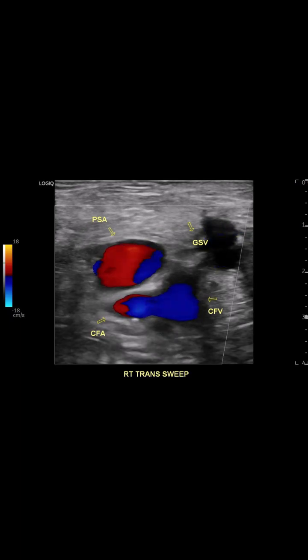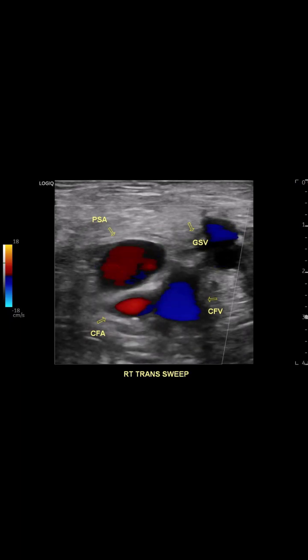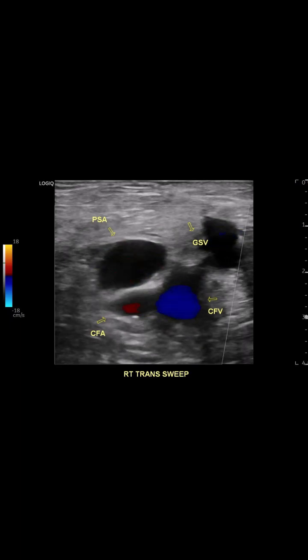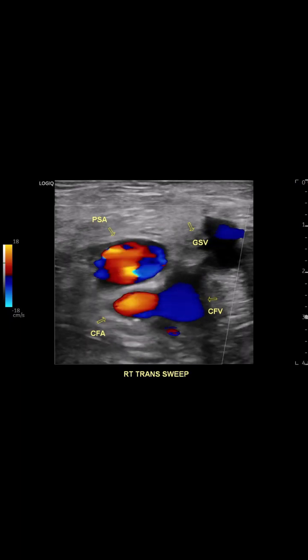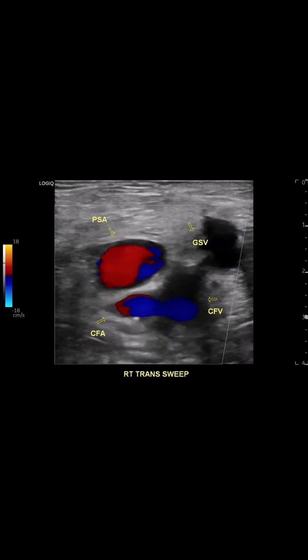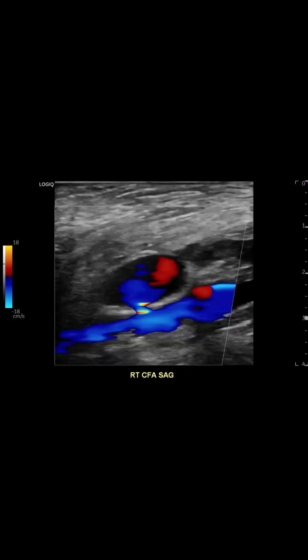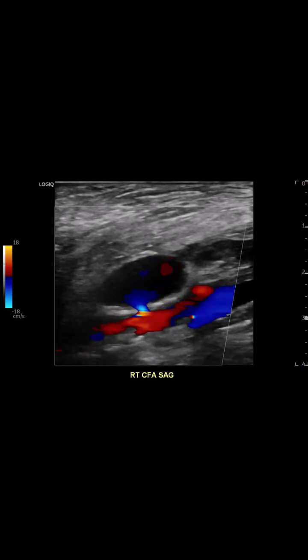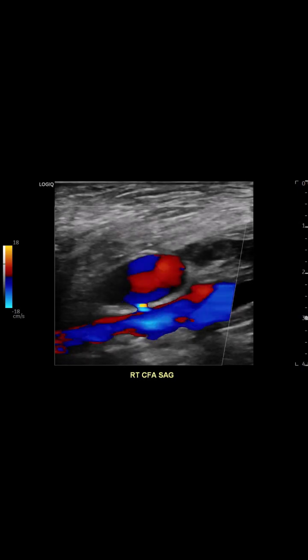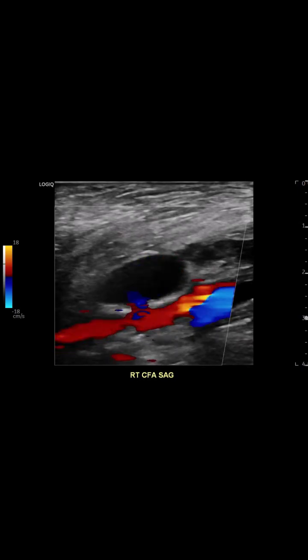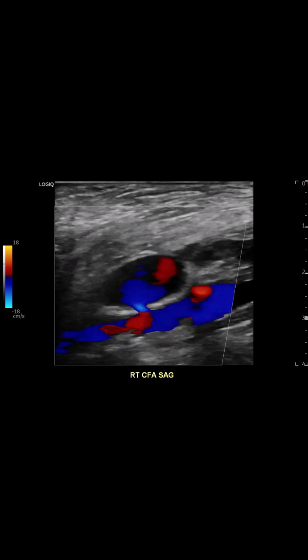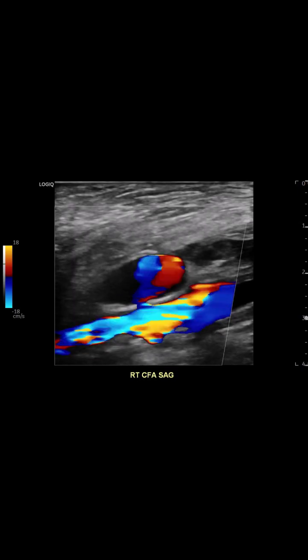In this transverse clip we see a pseudoaneurysm — a false aneurysm — arising from the mid common femoral artery. In the sagittal view of color flow we clearly see a narrow neck feeding blood into the chamber.